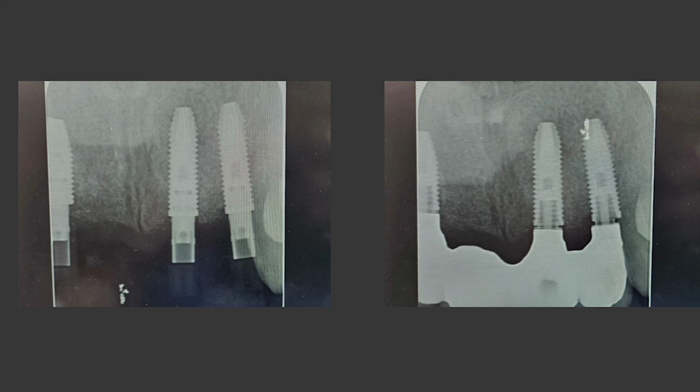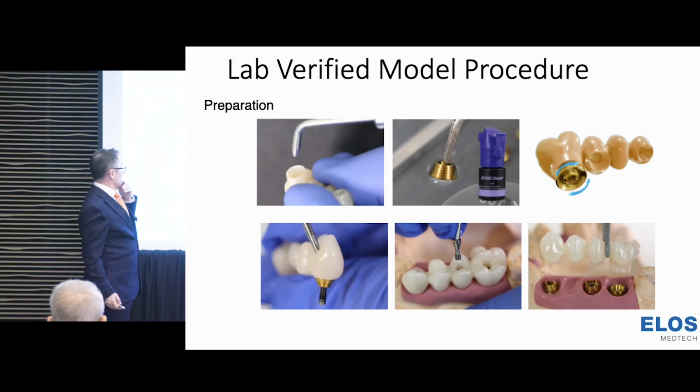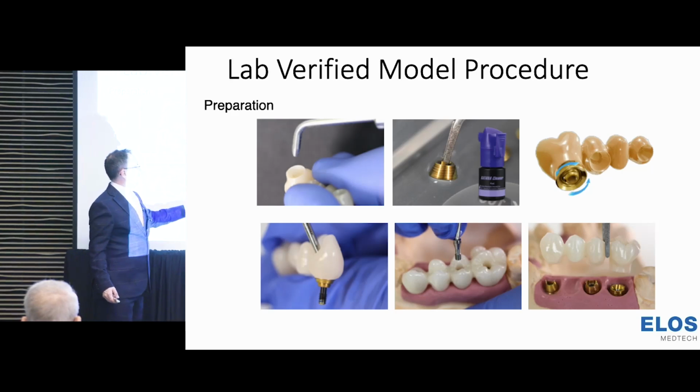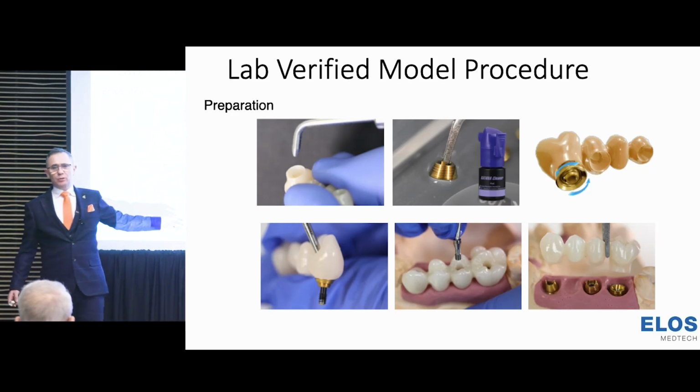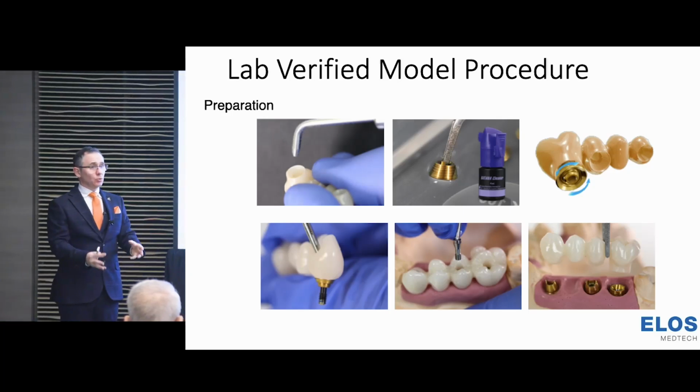And we're literally now in the last 5 minutes. So this is interesting, from acquisition to the bridge not fitting. Why does that bridge not fit? What's going wrong? Well, a number of things are going wrong. Do you remember how in the lab, what do we always trust? The model. The model was master. Everything was worked to the model, always.